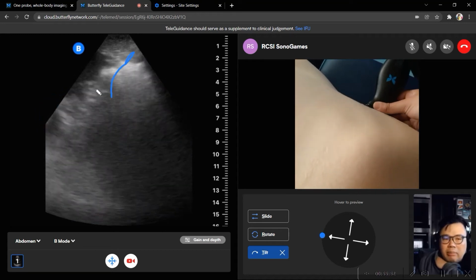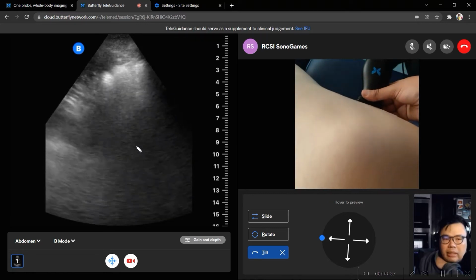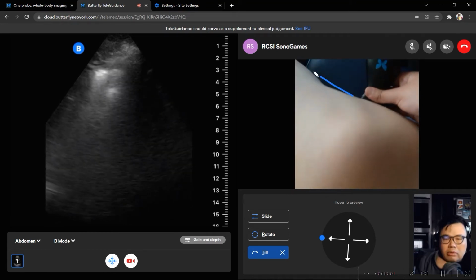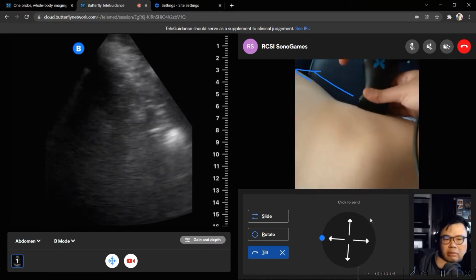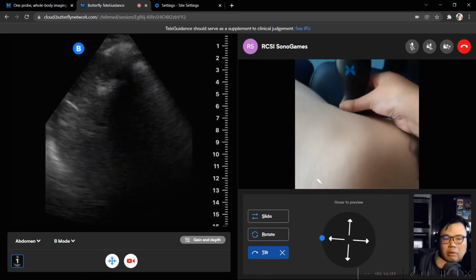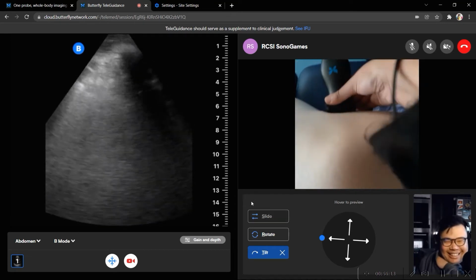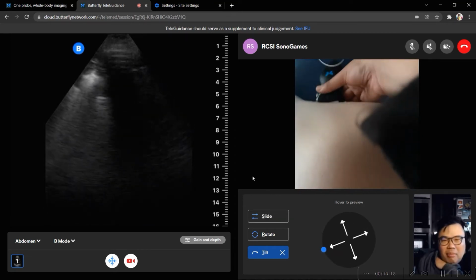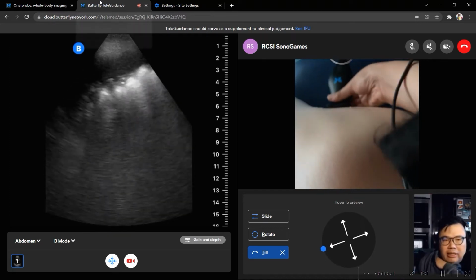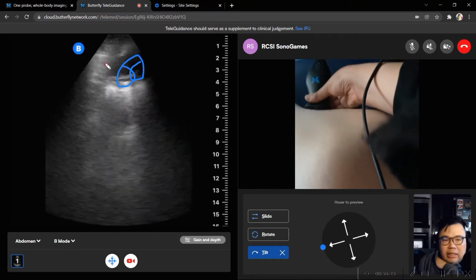Okay. So lots of bowel here still. So if you tilt the probe tail up a little bit, okay, and you need to go more superior in that direction. Oh no, his spleen disappeared. So remember what I told you, your hand must be almost on the bed itself, right? Oh, okay. There you go. So you can start to see the spleen coming in here.